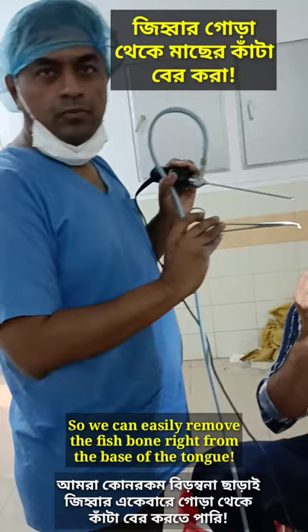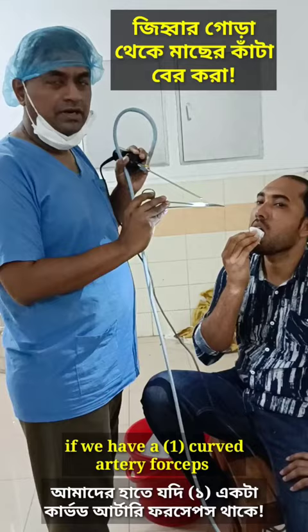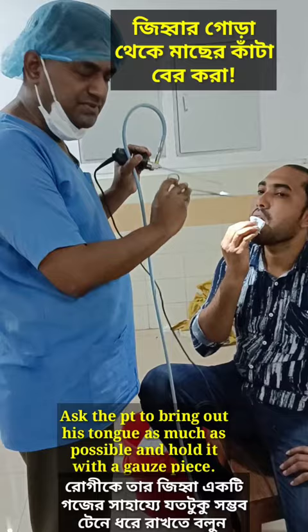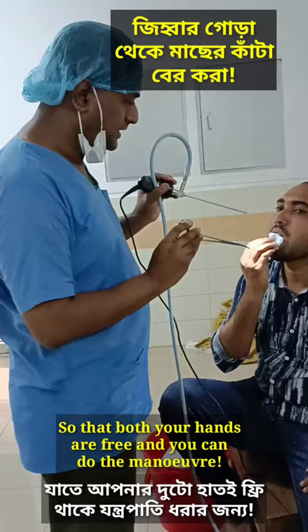We can easily remove the fish bone right from the base of the tongue. If you have a curved artery forcep, a simple curved artery forcep, you have to have a 70 degree scope. Hold the scope and ask the patient to protrude his tongue as much as possible. The patient will cooperate so that you have a free hand to perform the maneuver accordingly.